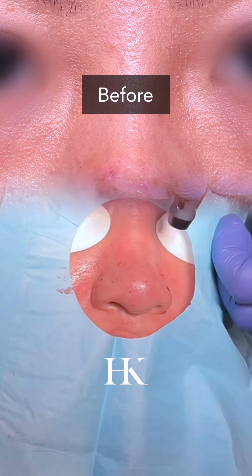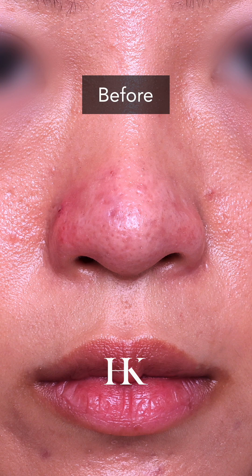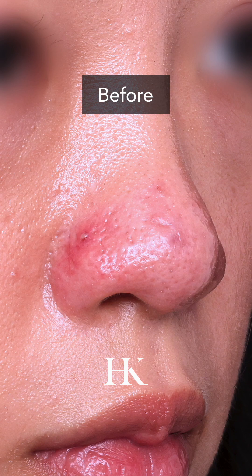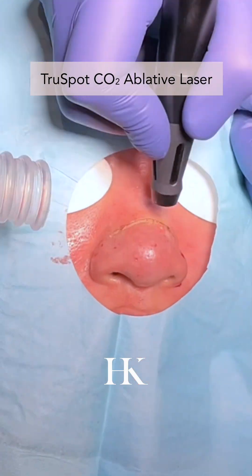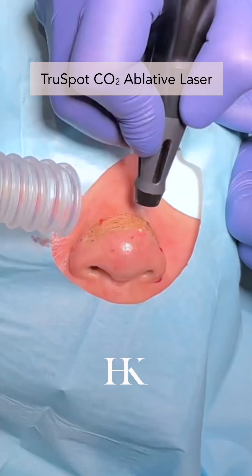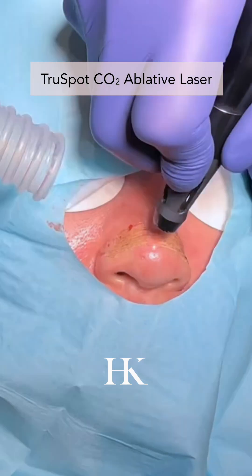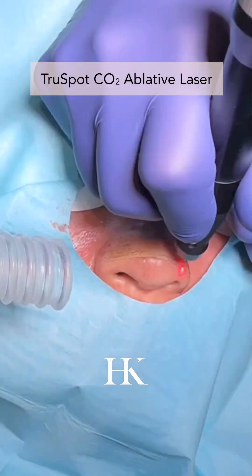Hi guys, it's Dr. Korasani. Welcome to another video. In this particular video, I'm going to take you through a nose resurfacing. This patient has sebaceous hyperplasia, which is the growth of sebaceous glands on the nose, contributing to irregularity.